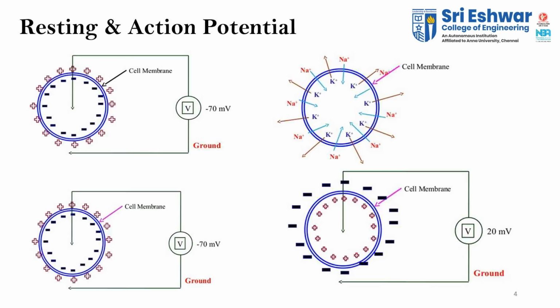Already you know the resting potential and action potential. Just to brush up: resting potential means your cell will not generate any ionic current. How is ionic current generated? By means of an external source. The positive and negative ions present in the cell move from one place to another, from inside to outside. That movement makes ionic current in the body, which will be grabbed by the electrode.